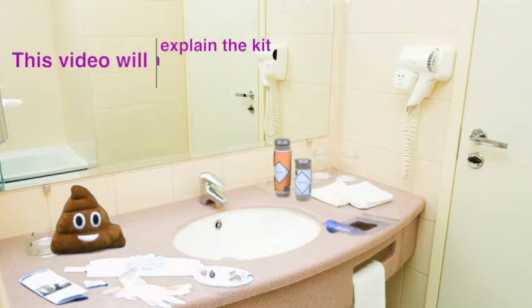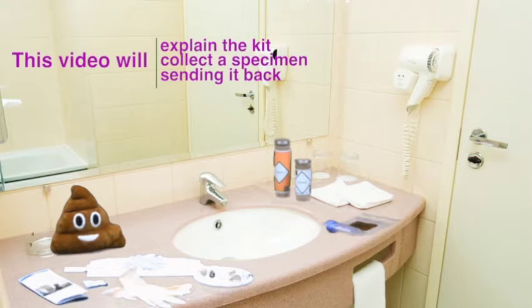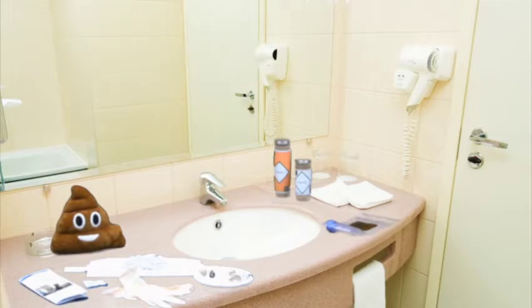During this video, we will walk you through what is in your kit, how to collect a stool specimen, and how to send it back.